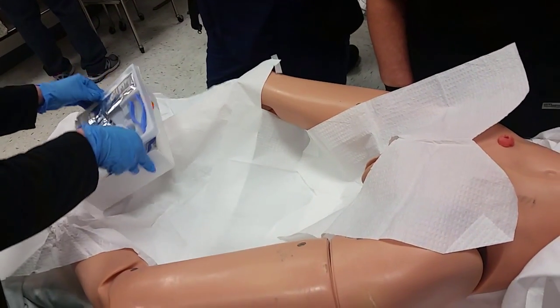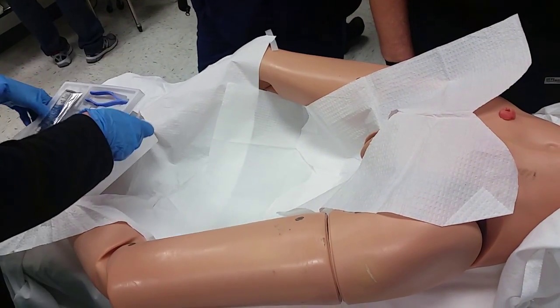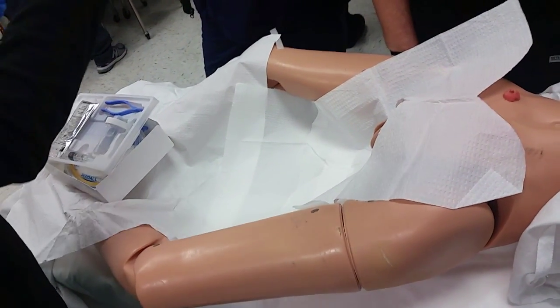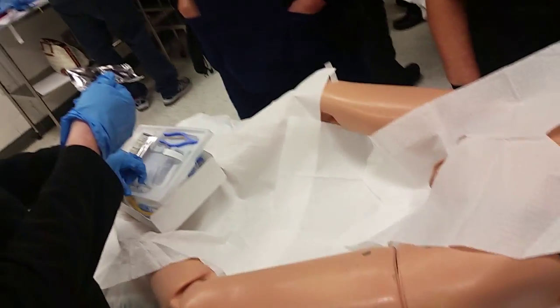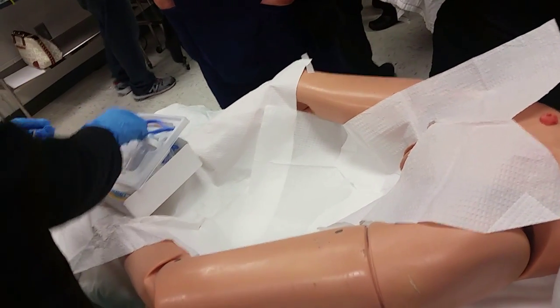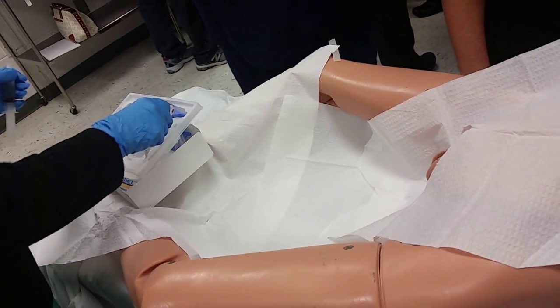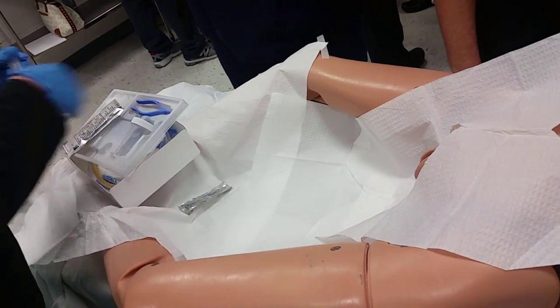You can figure out how to do the tray. Is this your KY? Sometimes it comes in a syringe like the water, so make sure you know the difference. You squirt it out and put it wherever you would like, then you drop it out.